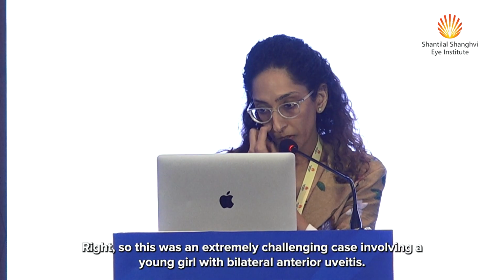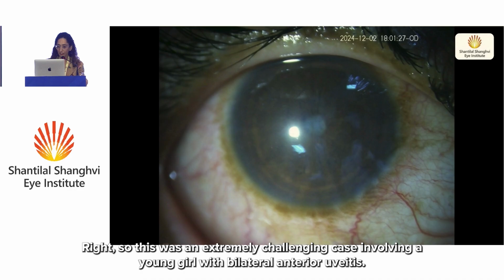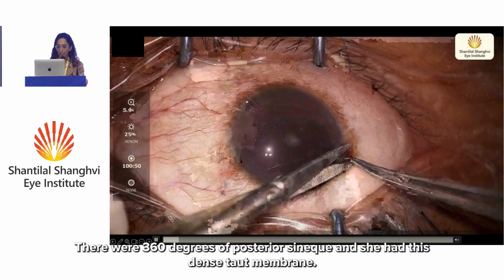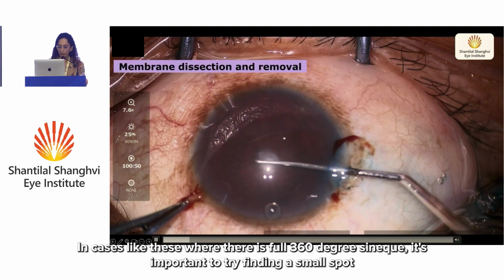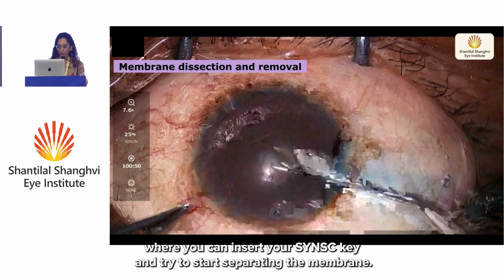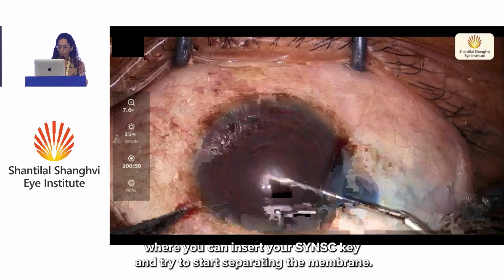Right. So this was an extremely challenging case involving a young girl with bilateral anterior uveitis. There were 360 degrees of posterior synechiae, and she had this dense taut membrane. In cases like these where there's full 360-degree synechiae, it's important to try finding a small spot where you can insert your Sinskey and try to start separating the membrane.